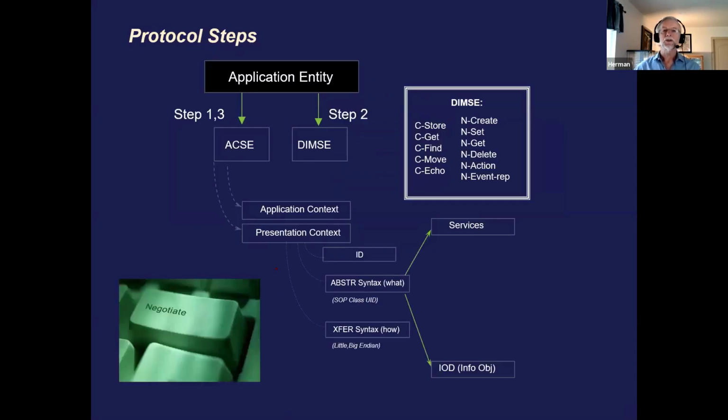When we propose a connection, from application entity to application entity, in step 1, we have these association control service elements, ACSE, kind of a DICOM trivia. What does ACSE mean? Association Control Service Element, and basically it means that you do an associate request to make a connection for step 1. With it, you set the presentation context. I say what I want to do. I want to do a DICOM worklist. And the transfer syntax, how we encode it.